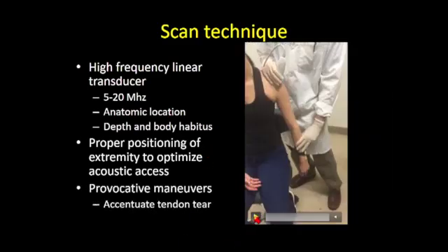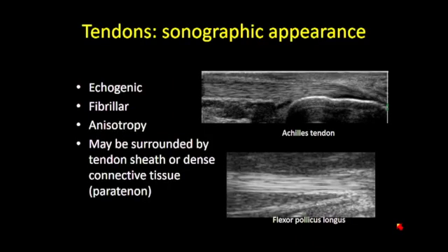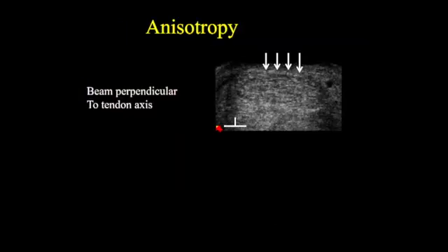Provocative maneuvers are always very helpful to accentuate tendon pathology and are something we can use to our advantage. A normal tendon, regardless of location in the musculoskeletal system, has a very echogenic fibrillar appearance due to the arrangement of extracellular collagen — as seen here with the flexor pollicis longus tendon in the thumb and the Achilles tendon in the heel. Tendons are echogenic, fibrillar, display anisotropy, and may be surrounded by synovial-lined sheath or fibroadipose connective tissue.